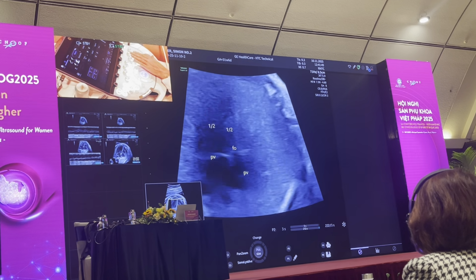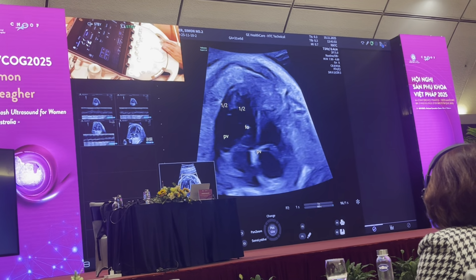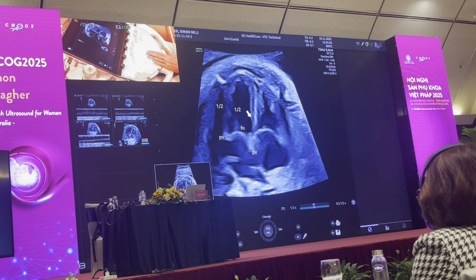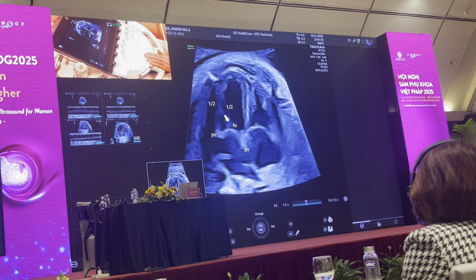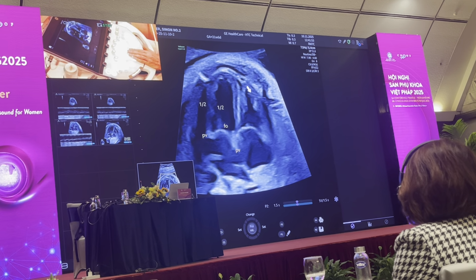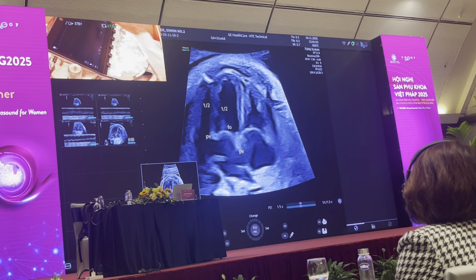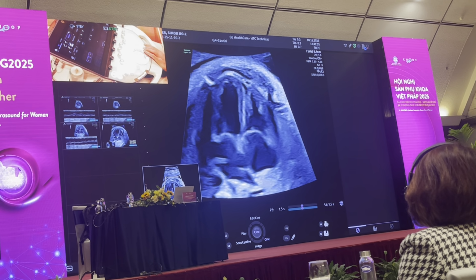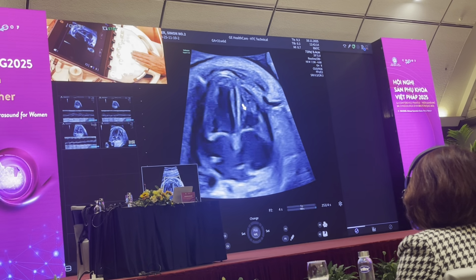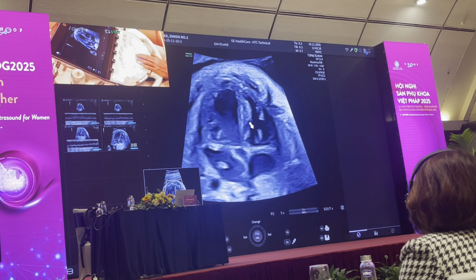When I look coming down to the left ventricle, you can see the left ventricle is smooth in comparison to the right ventricle. So this is the appearance of the left ventricle, which is smooth, and this is pyramidal in shape and it's rough, irregular. This is how you pick up congenitally corrected transposition, because the morphology of the ventricles is switched. And I can see that when I look at this ventricle, there is a moderator band coming across from this right ventricle and it looks normal.